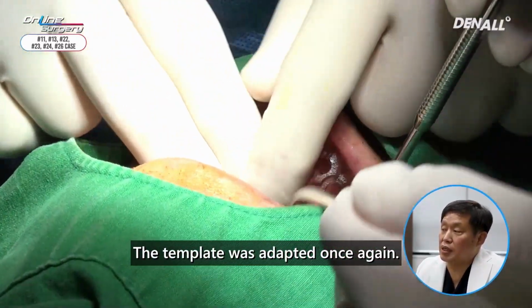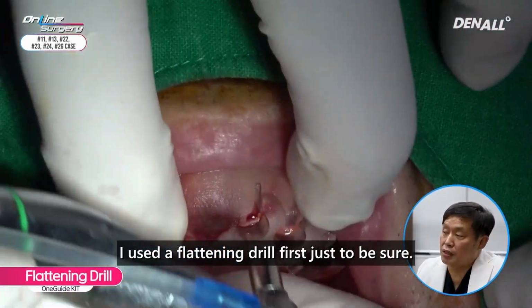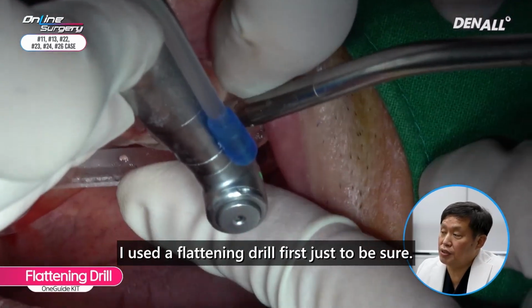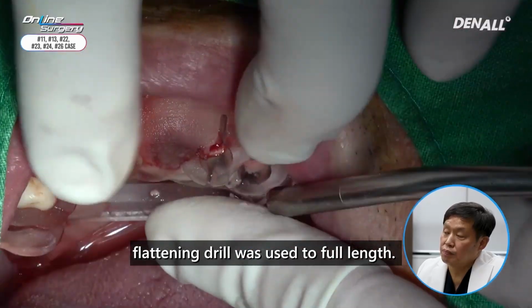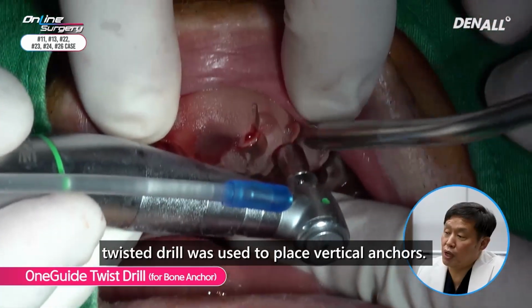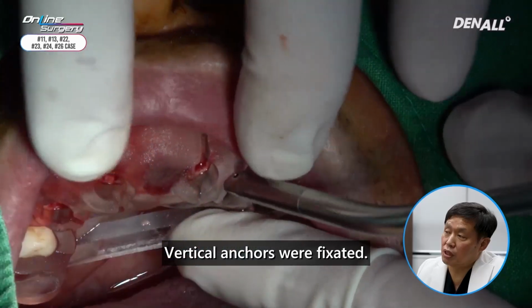Template was adapted once again. Vertical anchor will be used in number 23 first. Just to be sure, I used the flattening drill first. In number 23, flattening drill was used to full length. Then twisted drill was used to place vertical anchors, and vertical anchors were fixated.